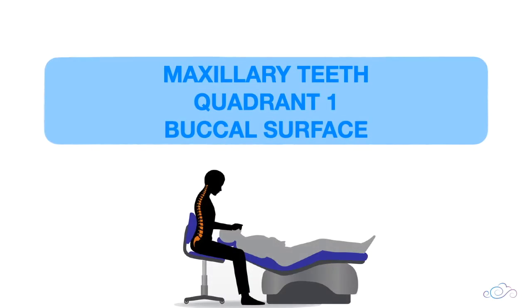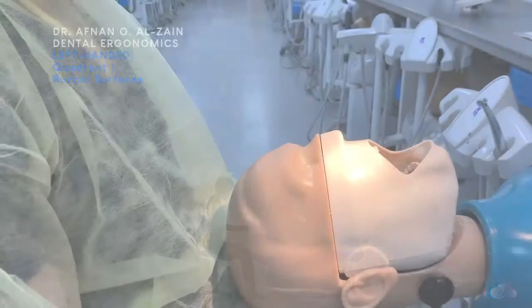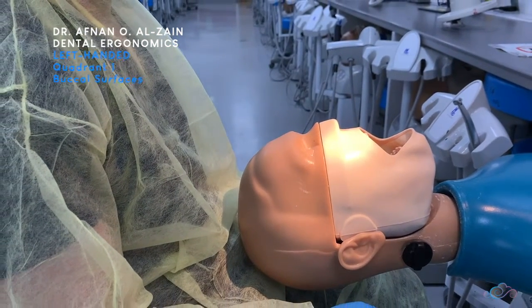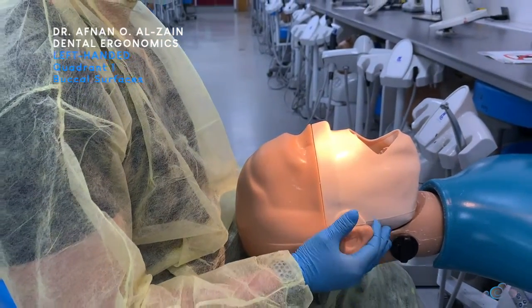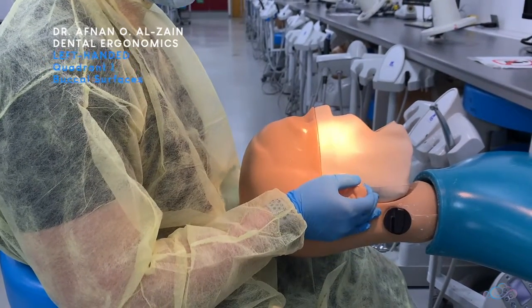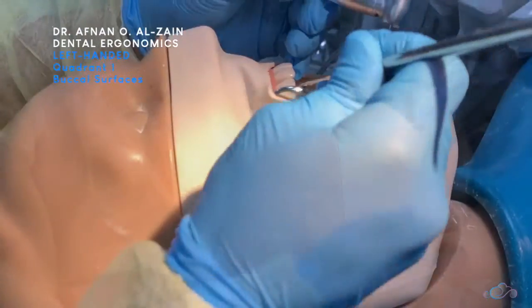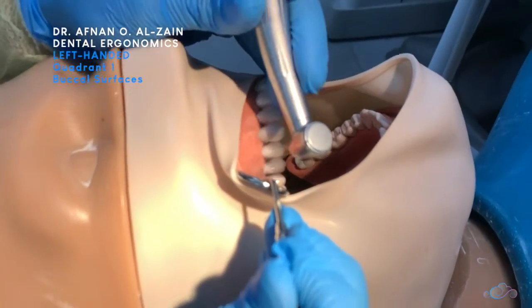Moving on to the buccal surfaces of quadrant one. When working on this surface, you're going to tilt the patient's head a little bit to the left, then you're going to retract the cheek, place finger support, and then look directly while working.